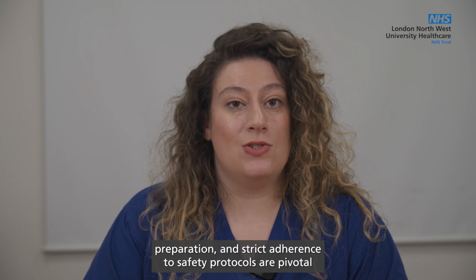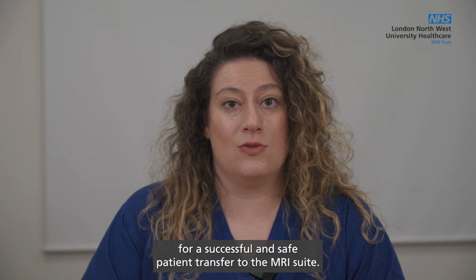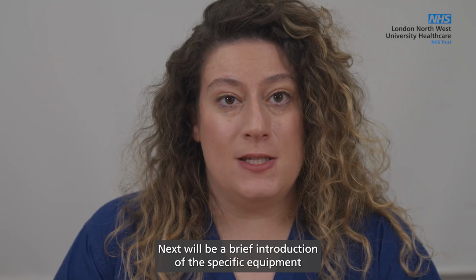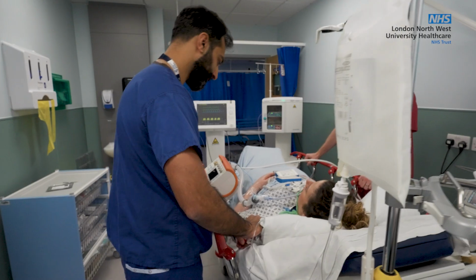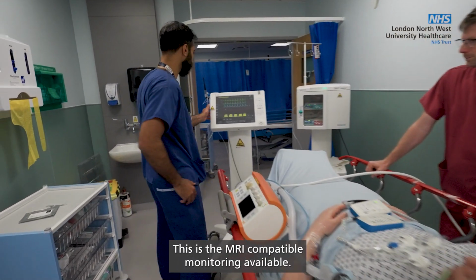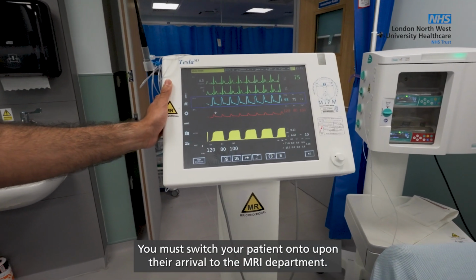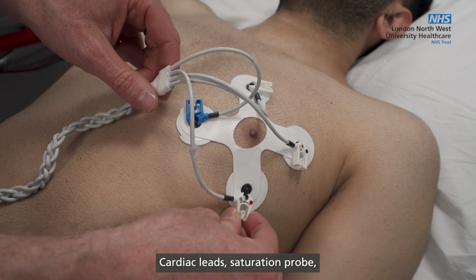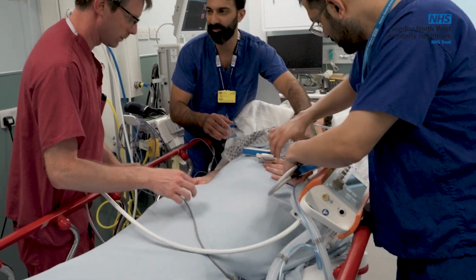In summary, preparation and strict adherence to safety protocols are pivotal for a successful and safe patient transfer to the MRI suite. Next will be a brief introduction of the specific equipment you will be using when you're in the MRI suite. This is the MRI compatible monitoring available you must switch your patient onto upon their arrival to the MRI department. Cardiac leads, saturation probe, blood pressure cuff, and arterial line transducers.